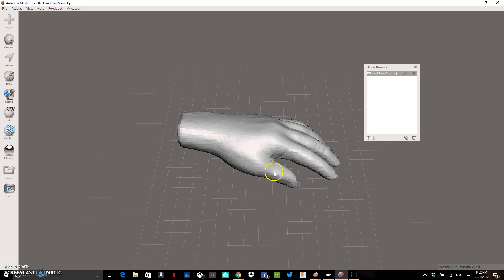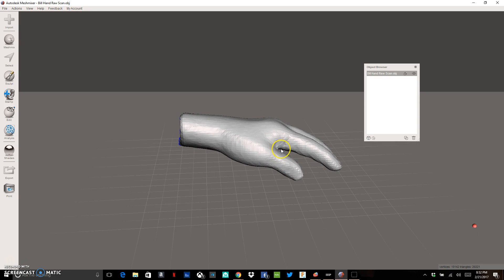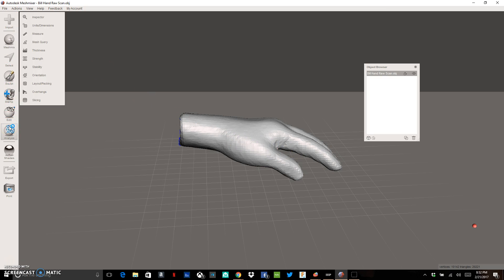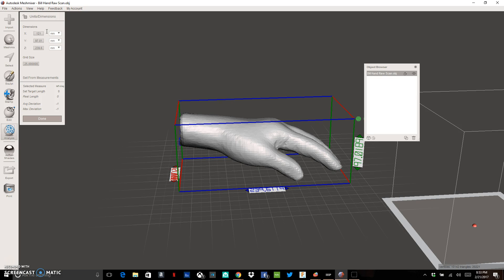I have some webbing of these fingers that I'm going to need to fix. The first thing I want to do is make sure everything is scaled correctly, so we're going to go to Analysis on the left-hand side, click on Analysis, and go to Units/Dimensions. This hand isn't actually 0.12 millimeters — it's a scan of an actual prosthetic that's about 121 millimeters, so I'm going to change that number to 121 and hit Enter to get the appropriate scale.